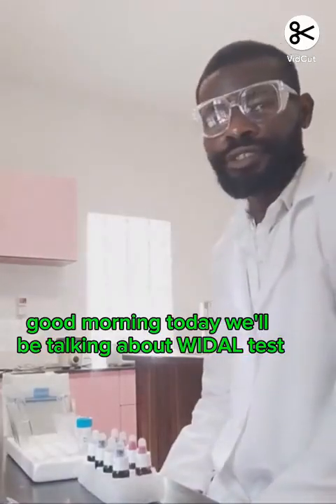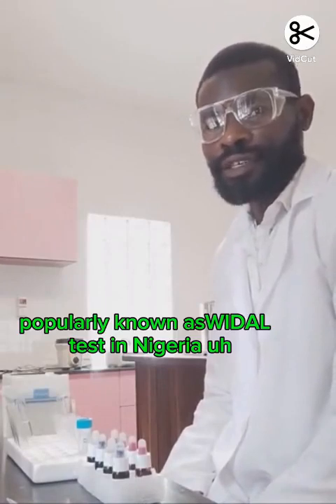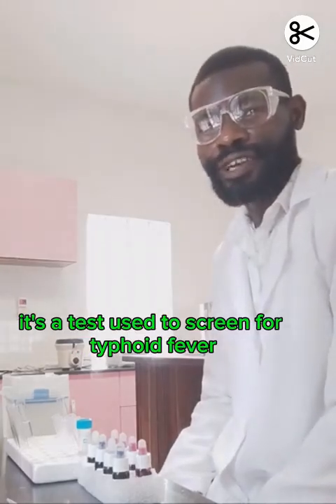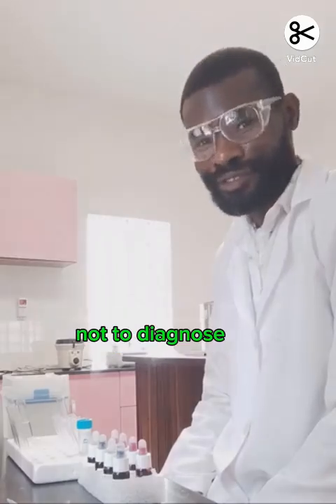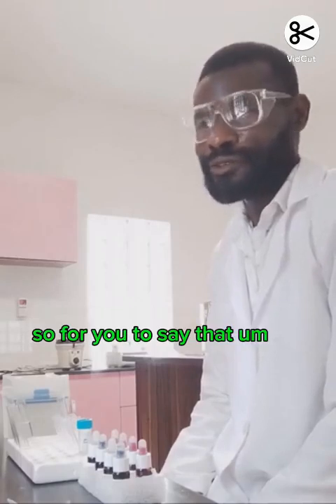Good morning. Today we'll be talking about the Widal test, popularly known as Widal test in Nigeria. It's a test used to screen for typhoid fever. Notice the word screen for typhoid fever, not to diagnose. So you see the difference there.